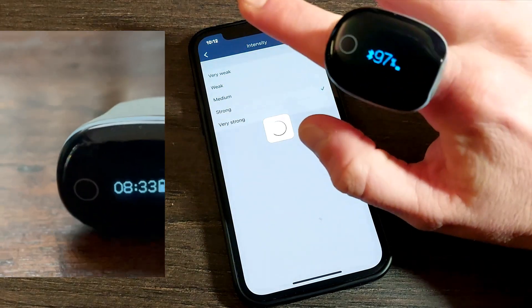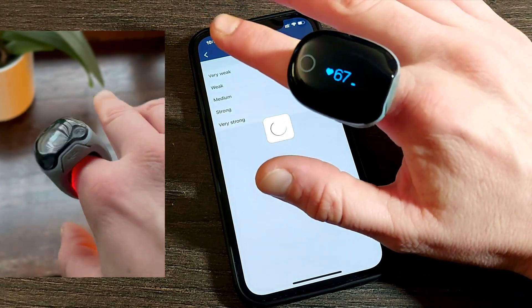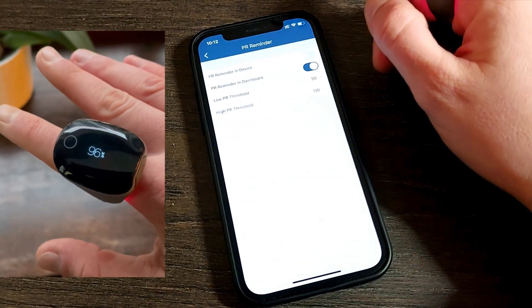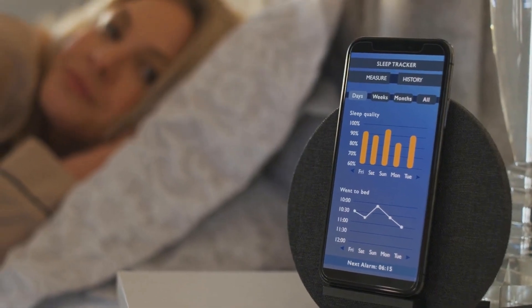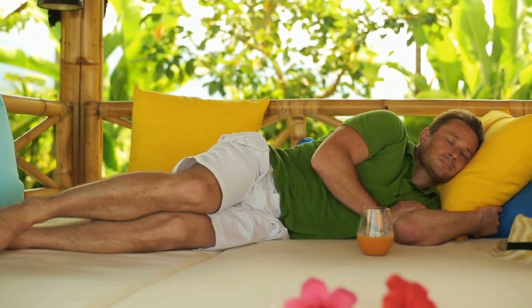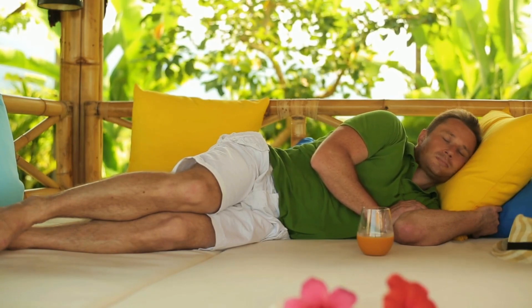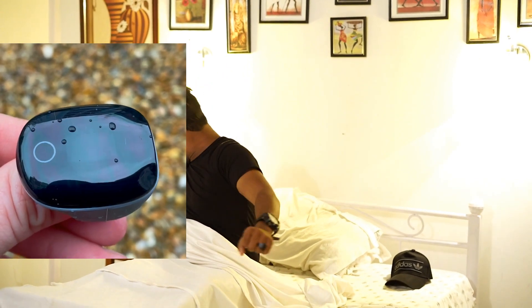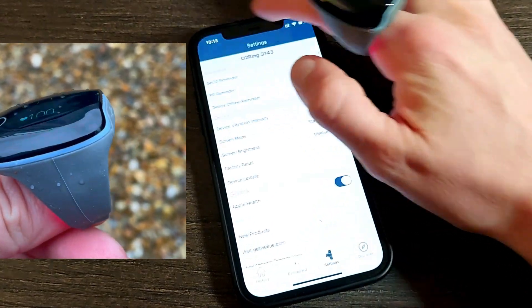The O2 Ring can be used any time during the day or night, but I mostly use it at nighttime — this is when I can pick up signs of hypoxia, sleep apnea, and measure resting heart rate, which is a key input for heart rate variability and the general state of the autonomic nervous system (ANS). I set my vibration intensity to strong since I'm a deep sleeper. The vibration alert is very useful, waking me up if my vitals drop below a certain SpO2 level and prompting me to shift sleeping positions.